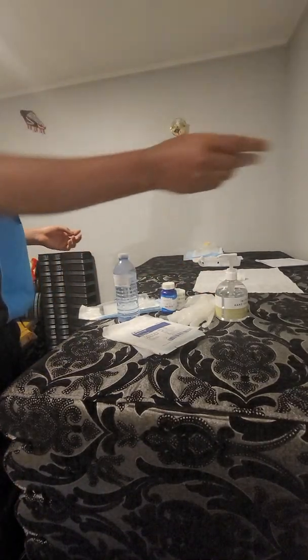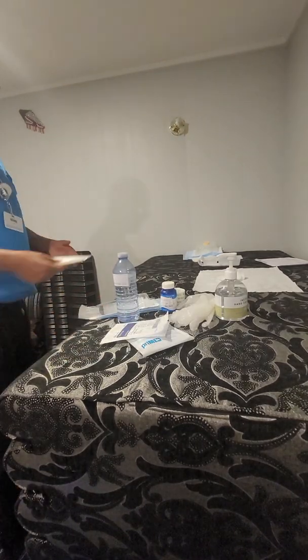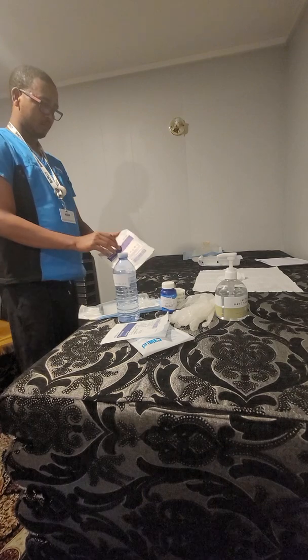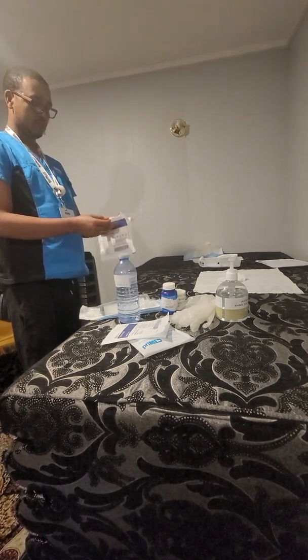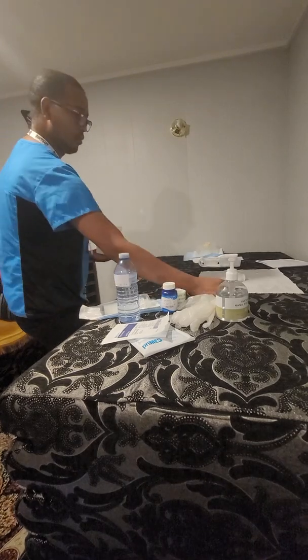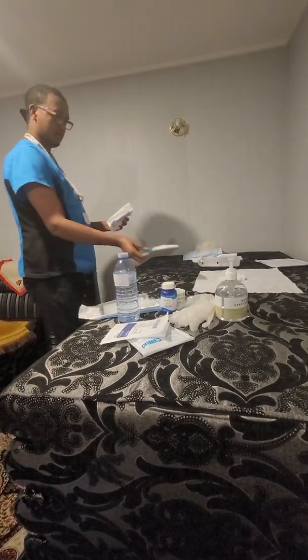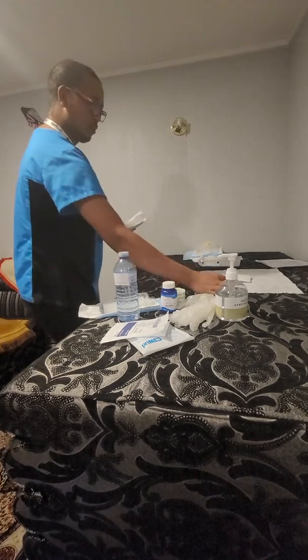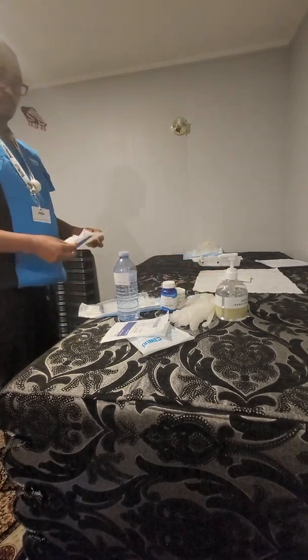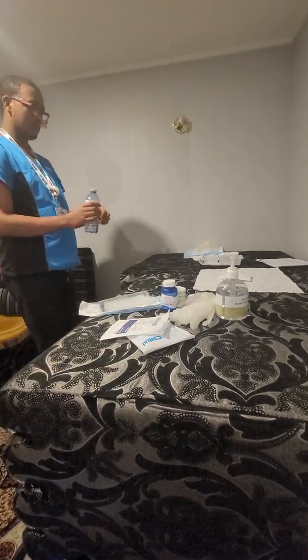put in a garbage. Okay, abdominal pad, peel it, put in a garbage. So I'm gonna just pour it.